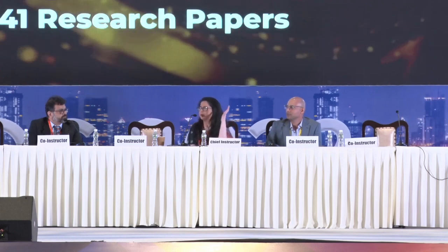So if one of your patients has, we know about this negative dysphotopsia, and especially with the IQ platforms, they keep complaining of a temporal dark black shadow. So if you've had a patient who's had a presbyopic IOL and is having negative dysphotopsia, would you go ahead and do his other eye? Would you want to do the same lens, change the lens? Would you go for a monofocal in that case? And you waited for 6 months.